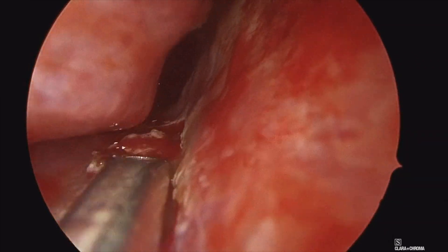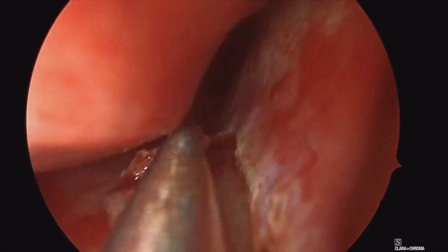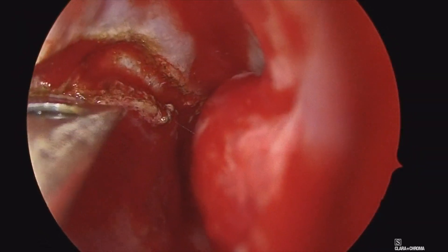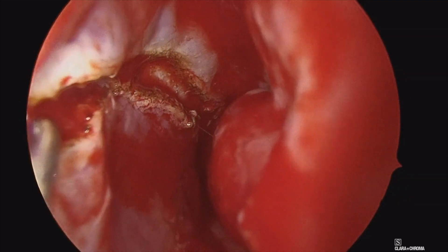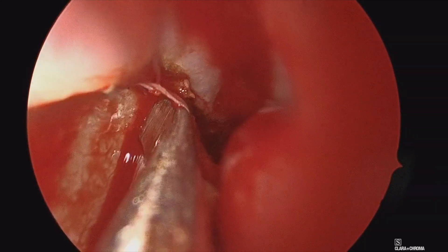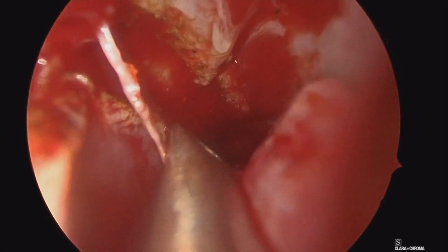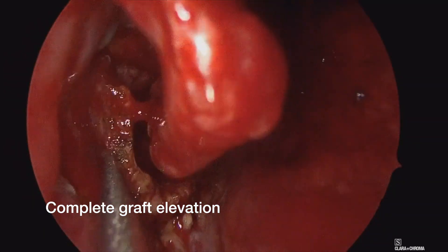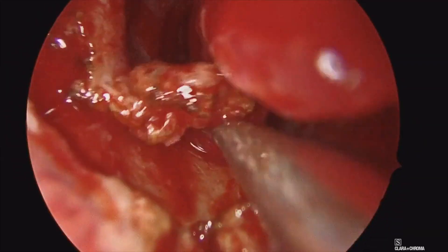Then once all those edges are released, I then tend to use a suction elevator like this suction freer in order to dissect the mucosa off the nasal floor and inferior meatus in a submucoperiosteal plane. I do like to keep the periosteum intact to make this a more robust graft. It's a little bit easier to work circumferentially towards the middle at least initially to make sure those edges are all nicely released, rather than simply going from front to back where you can get stuck in the back and have a hard time visualizing it.